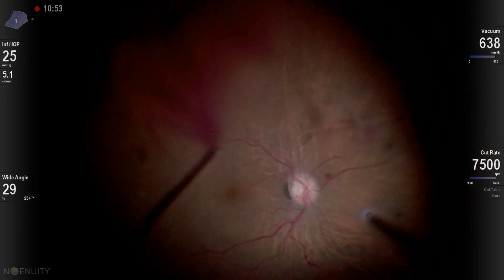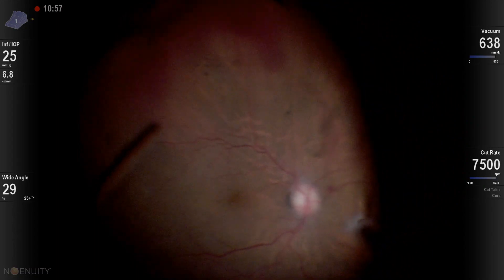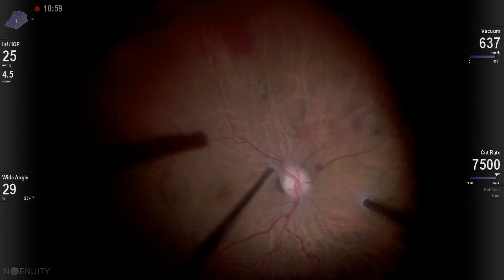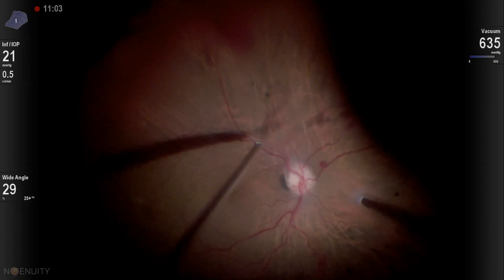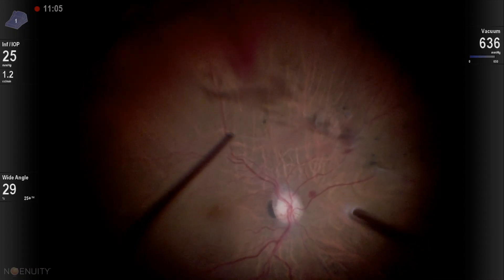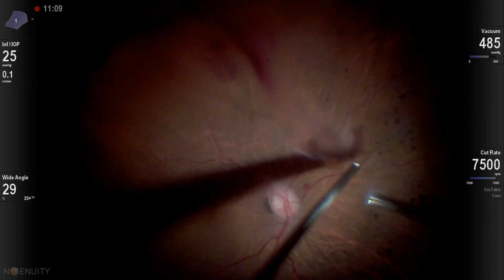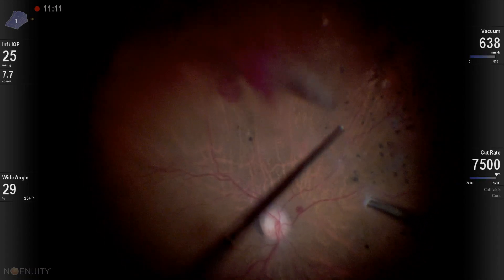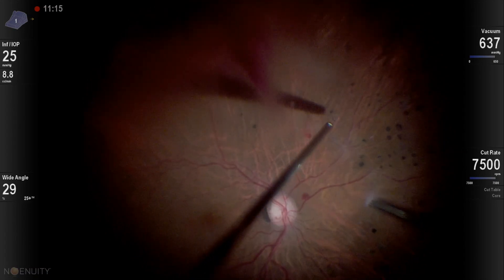To be efficient, you have to be cutting very deep at the level of the retina. Here I'm just separating another area — again, you have to be careful. Now back to that area, cutting very deep at the level of the retina.